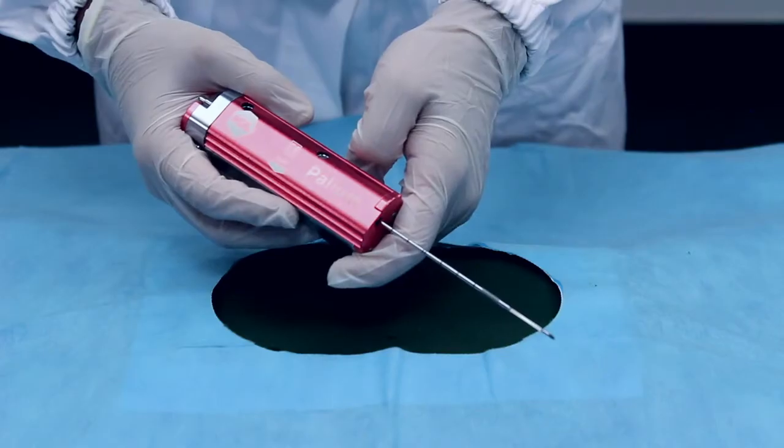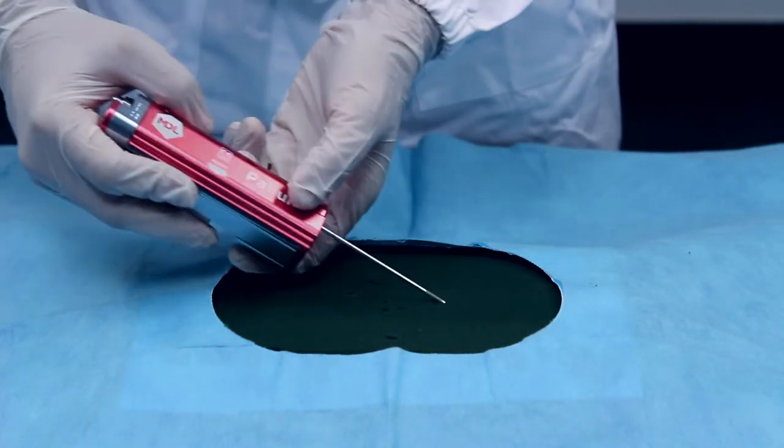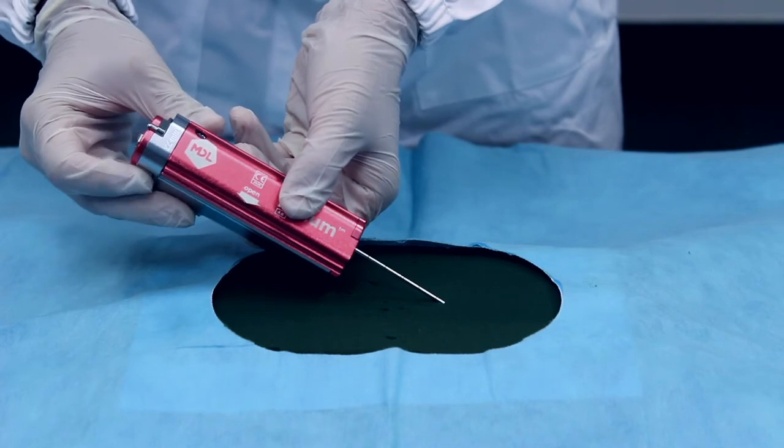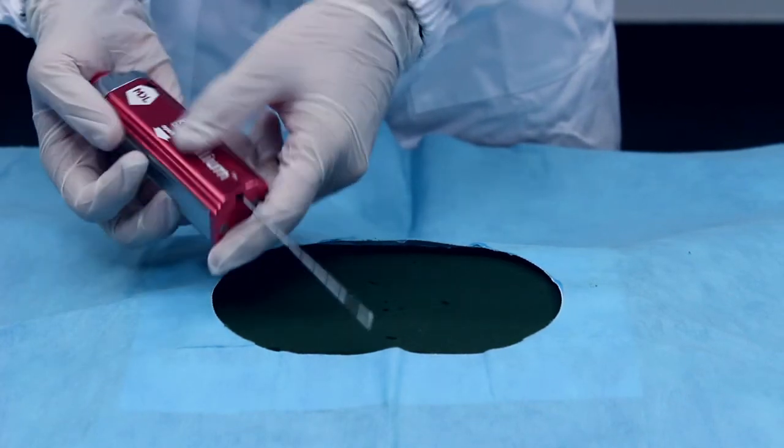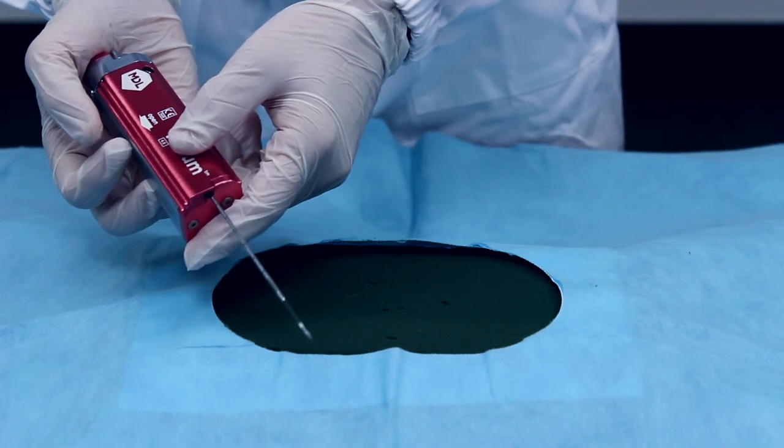To perform additional biopsies, load the gun completely again and insert the device into the patient until all the biopsies have been performed. Be sure to check the integrity of the needle before performing any additional biopsies.